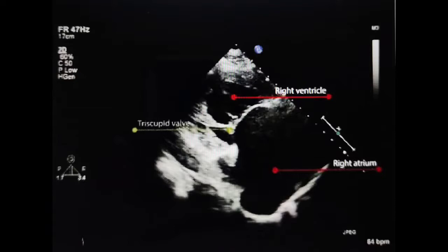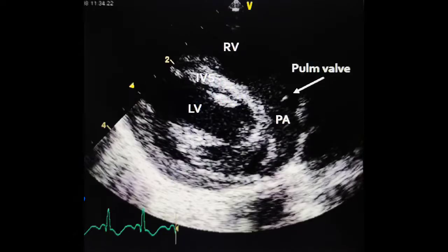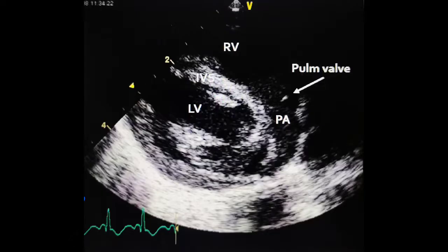In the modified parasternal RV outflow view, you can see the pulmonary artery, LV, IVS, and RV. The normal RV outflow tract dimension is 17 to 24 mm in diastole. In pulmonary hypertension, the pulmonary artery is dilated — generally more than 28 mm. Normal RPA is 7 to 17 mm and LPA is 6 to 14 mm. In parasternal short axis view, a D-shaped LV cavity indicates septal bulge in volume overload during diastole and in pressure overload during systole.